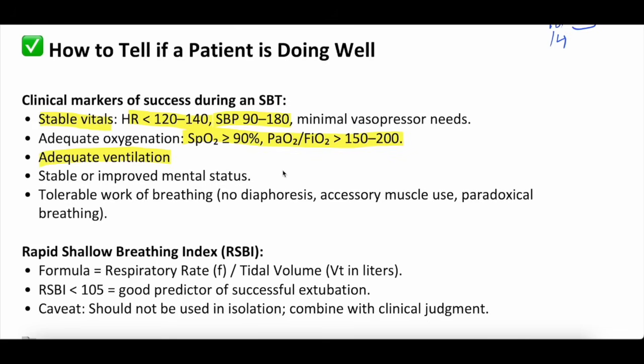Some people routinely send gases when patients are on pressure support trials. We don't tend to do that unless we have something we're worried about. Sometimes we'll leave them on end-tidal and make sure there isn't some big jump in their end-tidal CO2 on the monitor. But obviously, user preference on that one. But are they able to adequately oxygenate and ventilate?